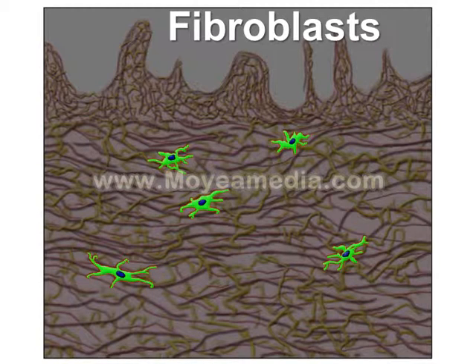Fibroblasts are present, which, without special stains, are difficult to distinguish from the immune antigen-presenting population. They become much easier to distinguish with immunostaining for factor 13A and CD34. The fibroblasts themselves tend not to be dendritic, whereas the truly dendritic population are the antigen-presenting cells.